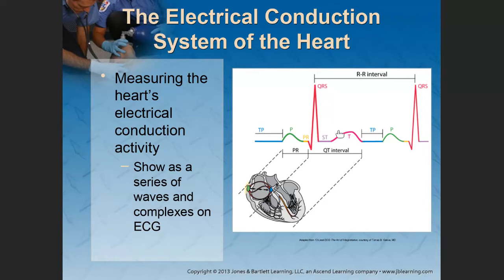Okay? And let's focus on the waves now. The P wave, the PR segment, the PR interval, QRS, ST segment, and T wave. We need to understand what these waveforms represent.